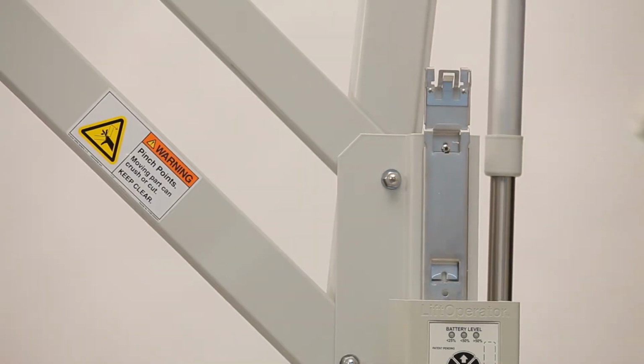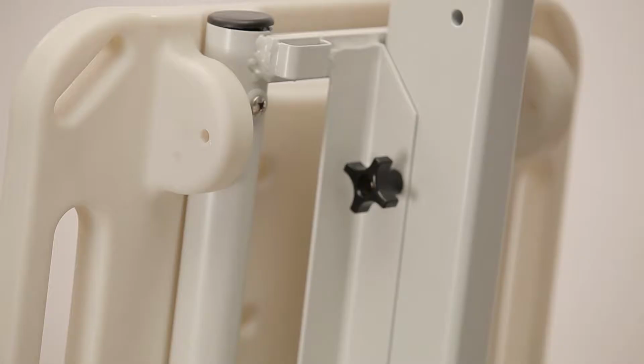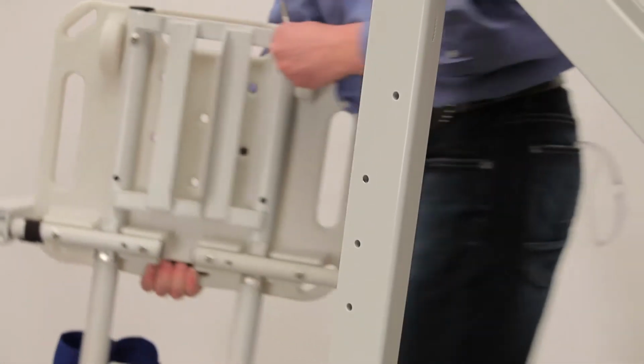To replace the actuator, remove the battery and unplug the actuator cable from the control box. Remove the seat assembly by loosening the thumb nut that attaches it to the arm. Then remove the bolt and the seat assembly.